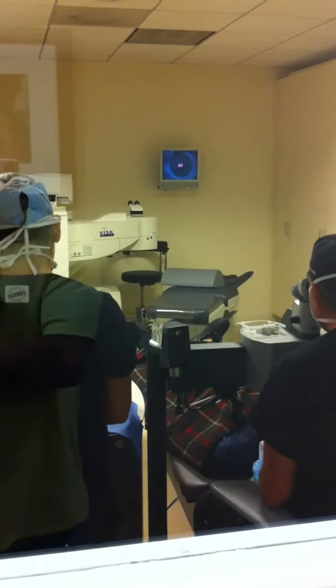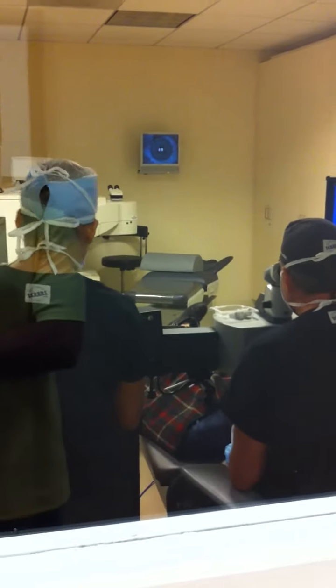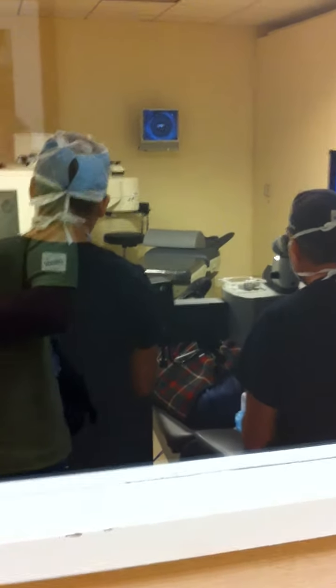So, if you're slicing the cornea open, how do you put it back together? This is like corneal thickness. He only scraped off this much of it. So it's transparent, right? So the rest of it's still there. So you don't have to put it back together. Outside of that silver ring, all the cells will pile into the middle, so it kind of just rebuilds itself. This is the part where they use the laser. They only scrape off a little.